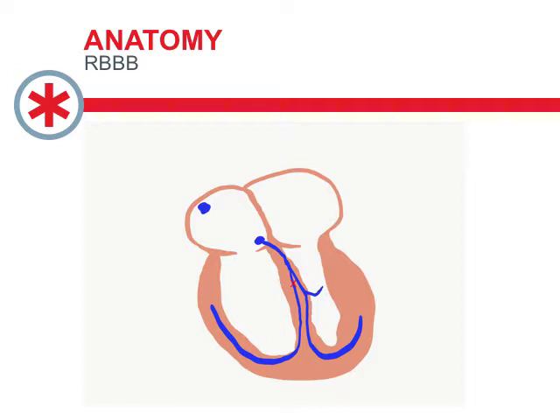That's going to mean a couple of things. It means that by and large, the first step of ventricular depolarization is going to look quite normal, where the interventricular septum depolarizes pretty close to normal. And then you're going to get activation of the left ventricle in a pretty normal fashion. And following that, you're then going to get the delayed activation of your right ventricle.